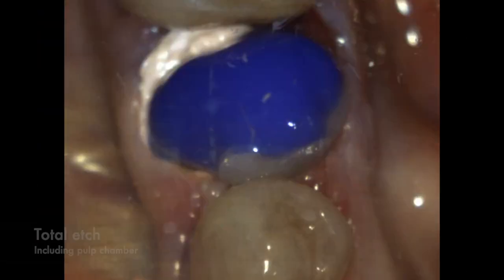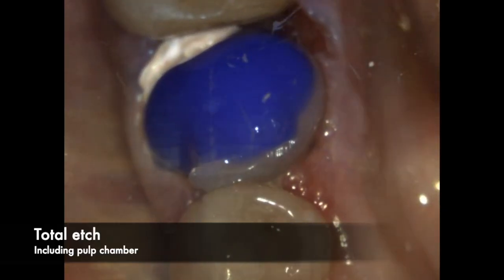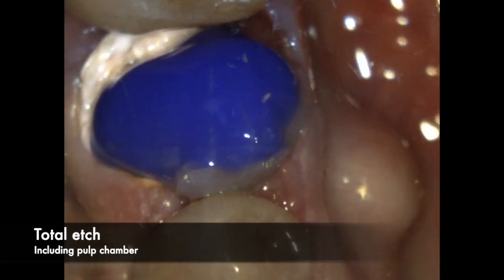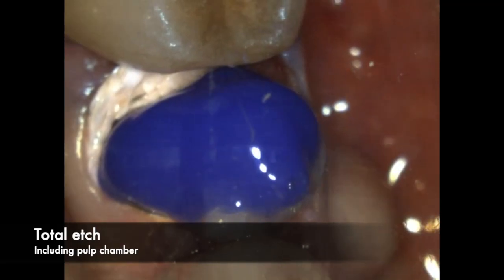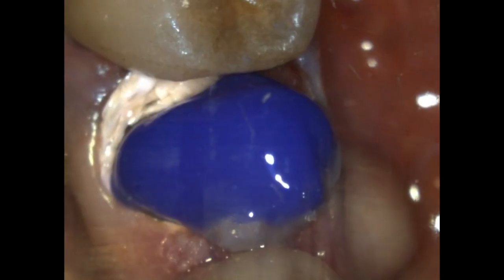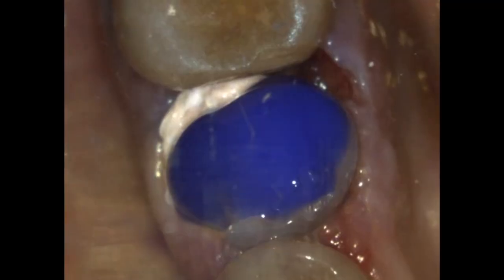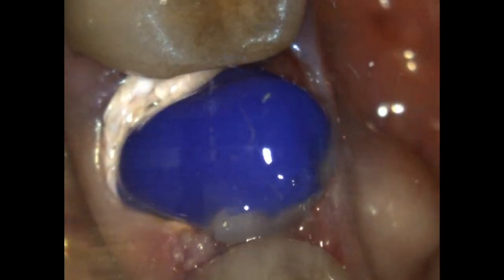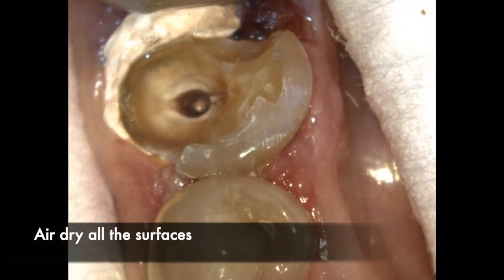After the right post size has been selected, we start the process of creating the buildup. The first step is to do a total etch of all the surfaces — as you can see I am etching all the surfaces including the pulp chamber. Once all the surfaces are etched, you wash out the etchant and dry it completely, starting by air drying all the surfaces to ensure a very clean surface.